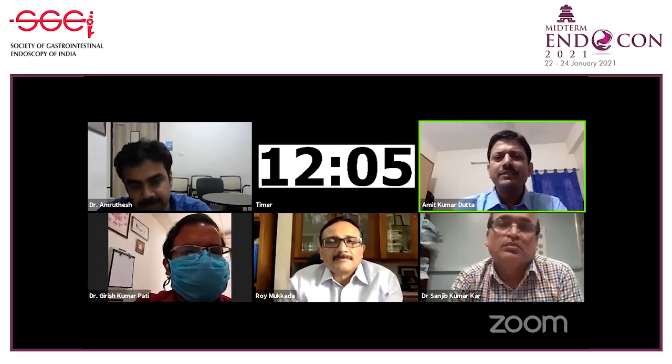What do you think, Amit? Yeah, for me, EMR and polypectomy I do straight away. If it is an ESD, I would normally do it in another setting, because the conversation becomes a bit different. ESD needs patient communication and then a scan, because this is rectum and sigmoid, where we normally do these. We need to know the depth, and CT or MRI is quite good. So if it is an ESD-like lesion, I would not do it in the same setting. I would talk to the patient and get imaging. We do not have much experience with ultrasound, and I think CT is much better for lymph nodes and the surrounding area. So I agree with you, sir.